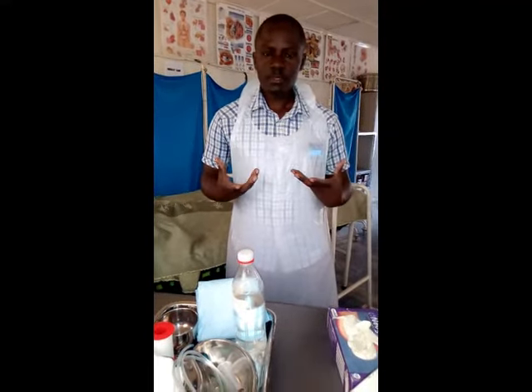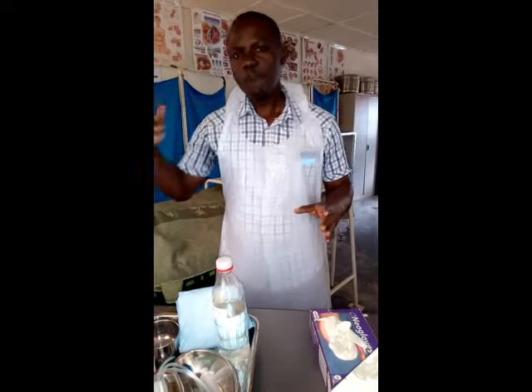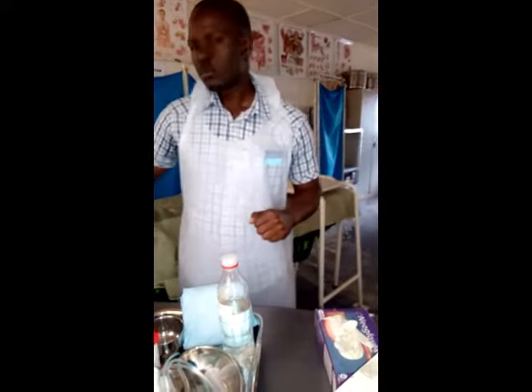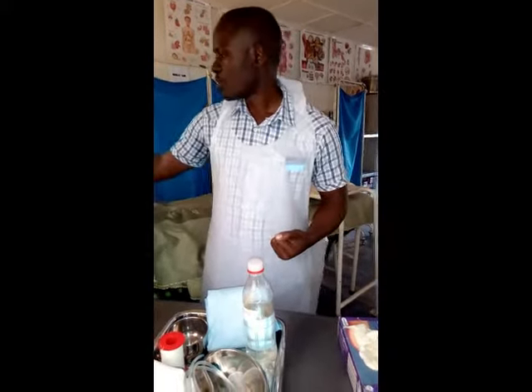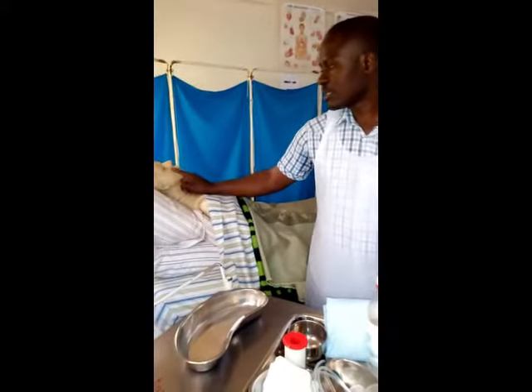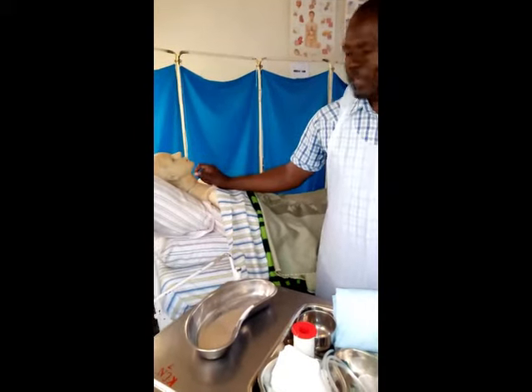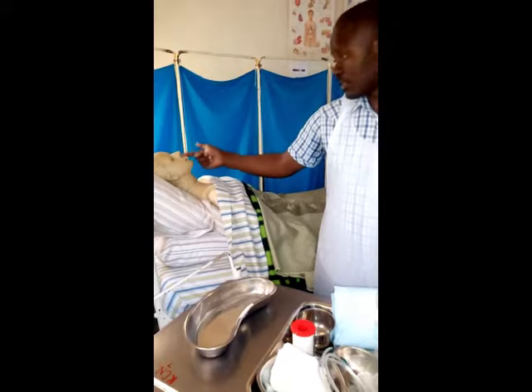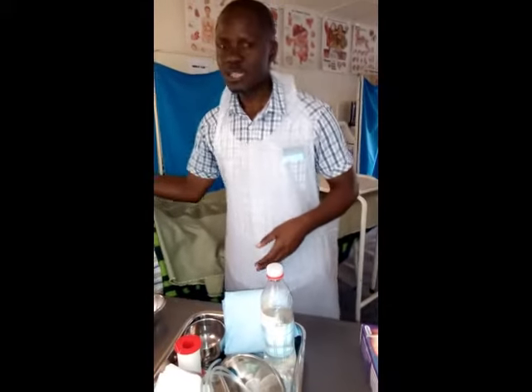So then at this moment I need now to select which nostril. Which nostril is patent and where I can insert. So then this procedure, you need to know that the more patent nostril, that's the one you insert, not the other way around. So if you find out that the right nostril is more patent than the left, meaning you have to insert in the right nostril. If it's the left which is patent, meaning insert there.